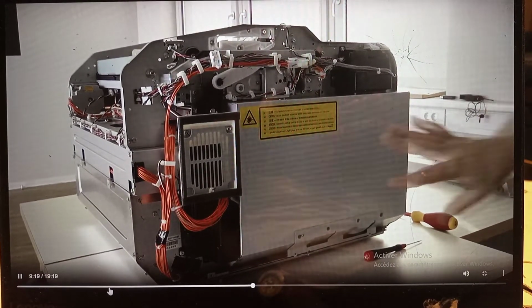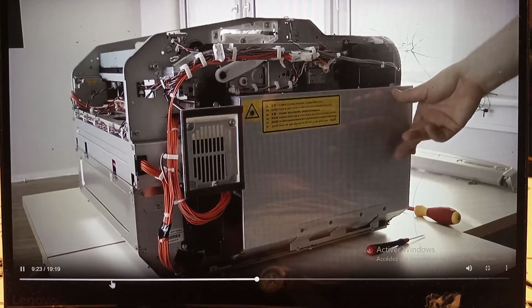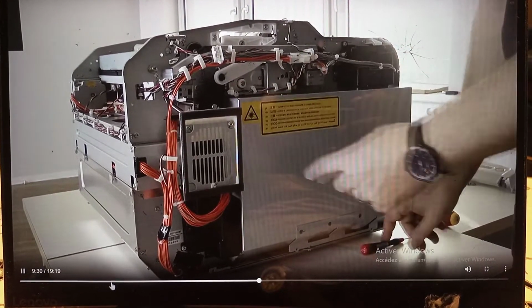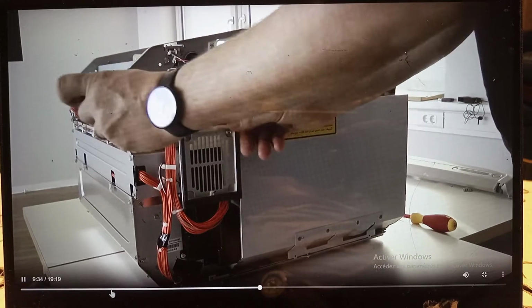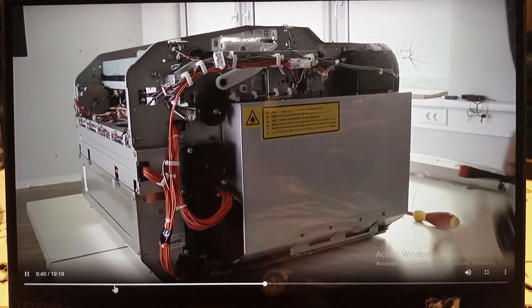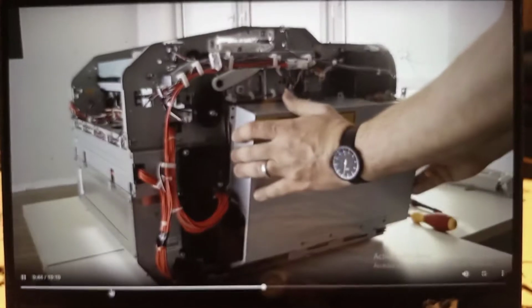To access the main boards on the device, you need to open this cover. So unscrew 8 screws around the cover. To access the left-sided screws easily, it's possible to remove the duct cover from the fan. So just open this like that, and after removing 8 screws, you can open the box.